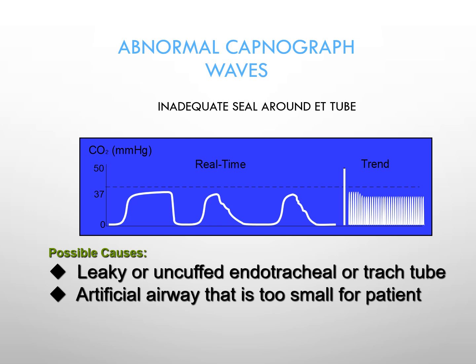Okay. Now let's take a further look. What can cause a leak? One of the things that can cause a leak is an issue with the endotracheal tube. Okay, the endotracheal tube may have become dislodged, or maybe it is at the vocal cords themselves. So, it may be positional. When the patient is positioned a certain way, it has a good seal, but then when they're not, there's not a good seal. It could actually be a problem with the cuff itself. The cuff could be blown.